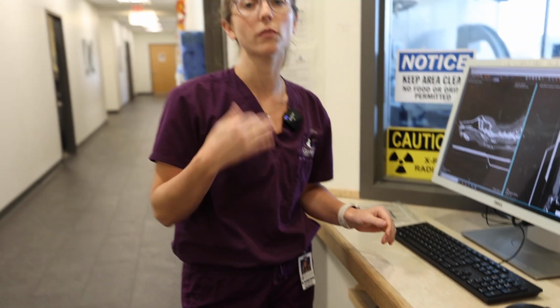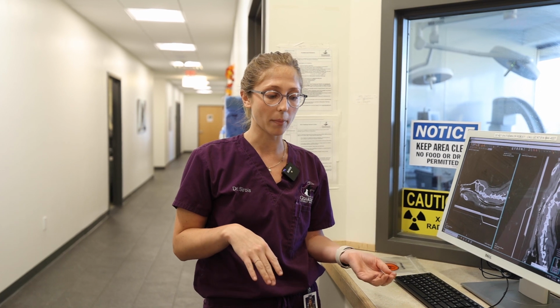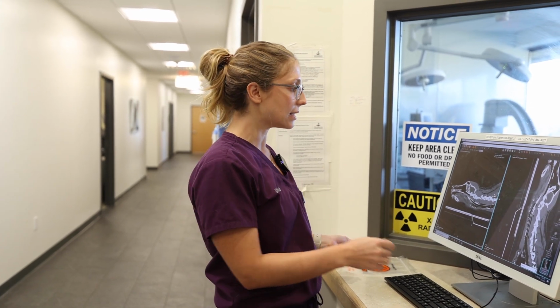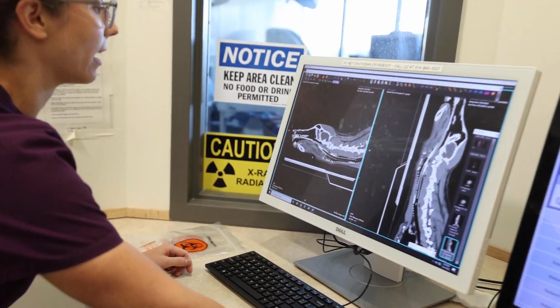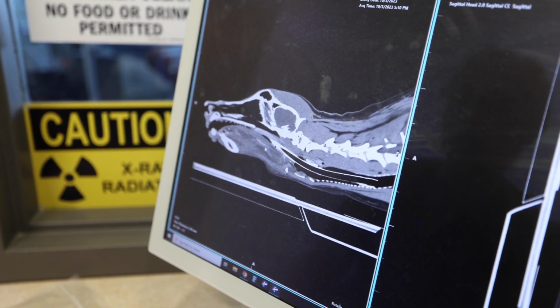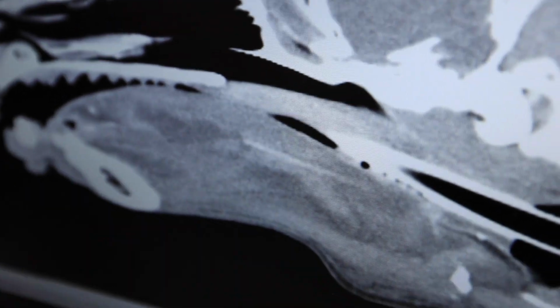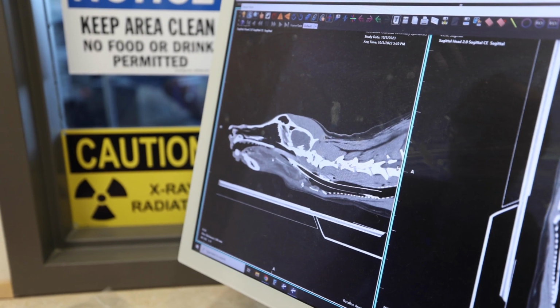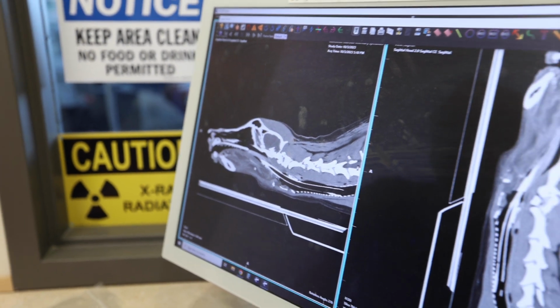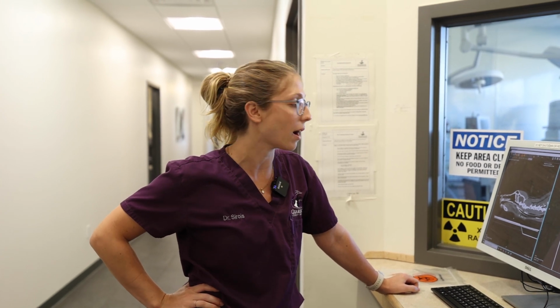But then the question was still what was going on with the swelling. It didn't really make sense that it was just from trauma from that toothpick passing. And so we did do a CT scan, and what you can see on the CT scan is that unfortunately this bright linear foreign object here is likely the second toothpick, and you can see it going almost the entire length of her tongue here, and it creates a little abscess here as well. And so when we got these images in the final report back, we knew that we were going to have to involve the surgery service to go in there and really explore the area and try to remove as much of that toothpick as possible.